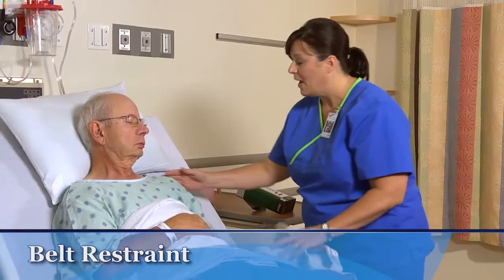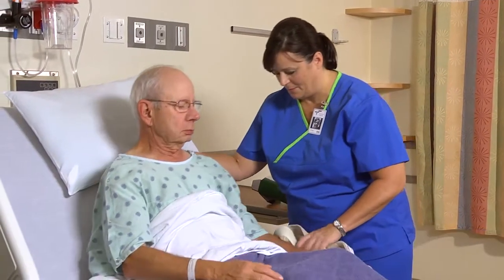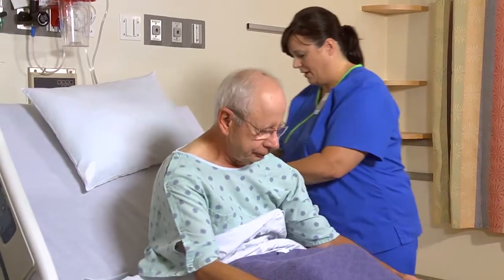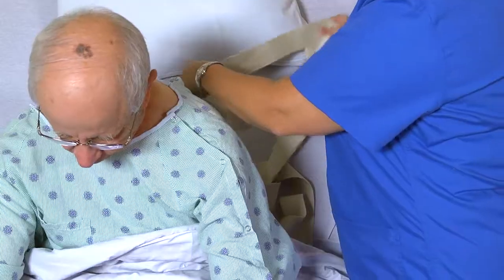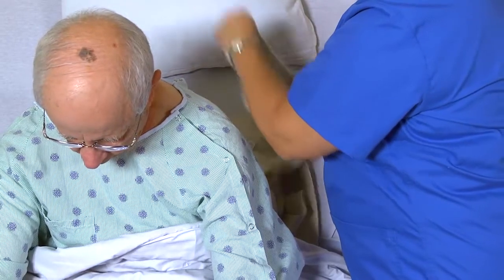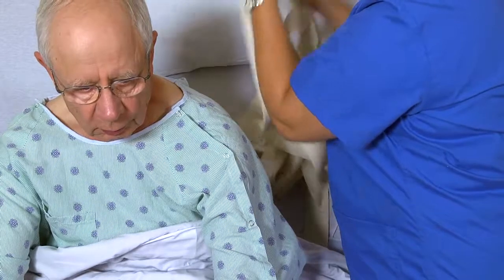To apply a belt restraint, help the patient into a sitting position in the bed. Place the belt over his hospital gown or pajamas and make sure to smooth out any large wrinkles or creases.